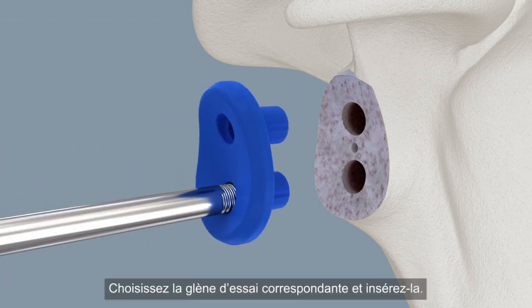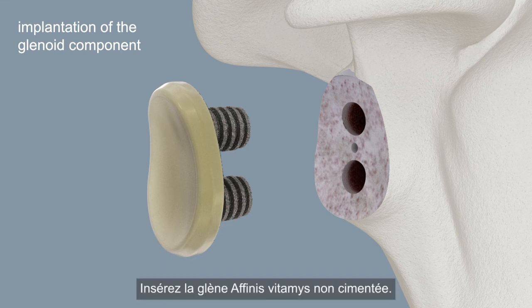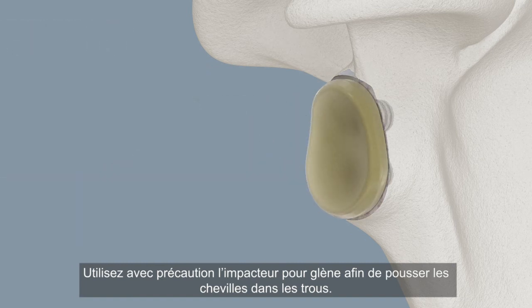Select and insert the appropriate trial glenoid. Insert the Affinis glenoid uncemented. Carefully use the glenoid impactor to drive the pegs into the holes.